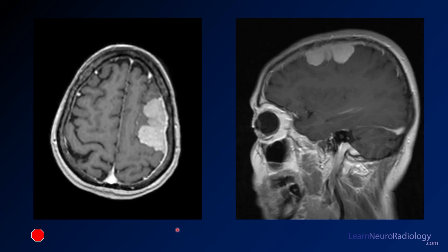Here we have a couple of additional post-contrast T1 images from thin-slice axial and sagittal views. You can see an abnormality there. Luckily, neuroradiology makes it pretty easy — there's a lot of asymmetry there which can really help you.